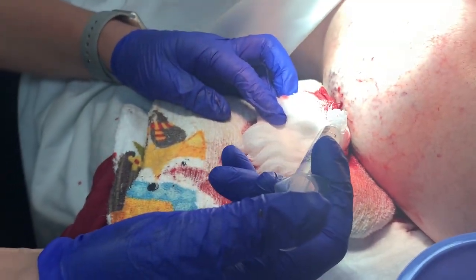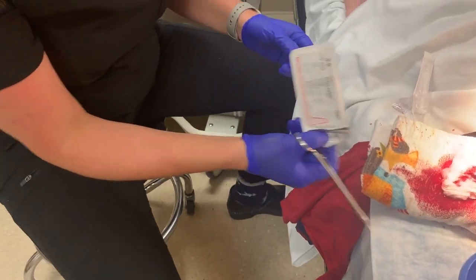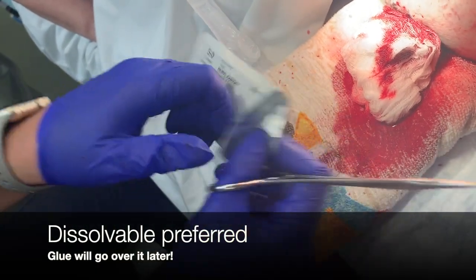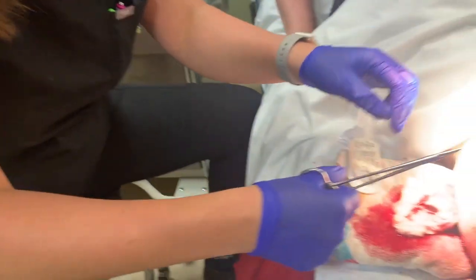You feeling much? A little bit. Should be getting numb now. So I'm just using a Vicryl 5-0 here, RP-S3. And I'm just going to throw in a suture. She should be numb.